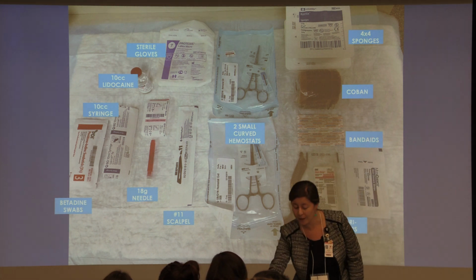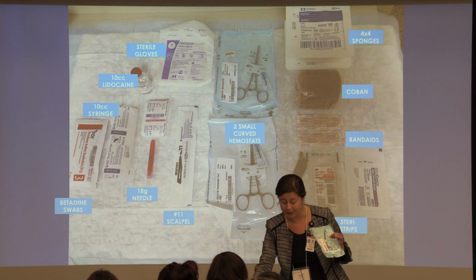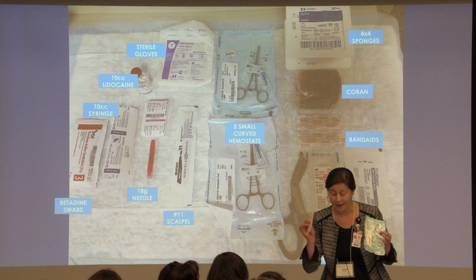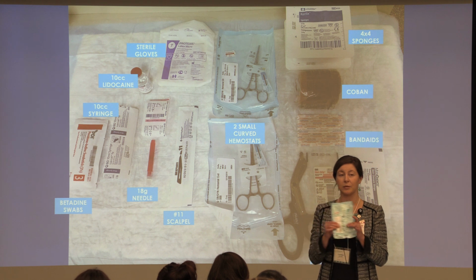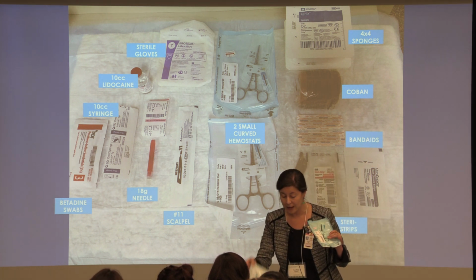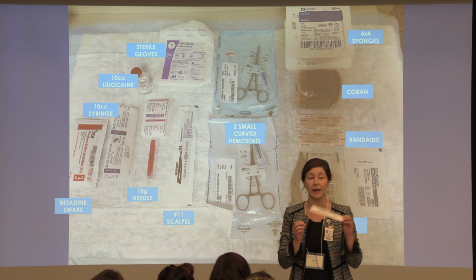And you guys are all welcome after to come up and see what we have here. So we went over these. You're familiar with our iodine, lidocaine. Maybe what you're not familiar with is the different types of hemostats that we use and that are available. Our scalpels using an 11 blade.